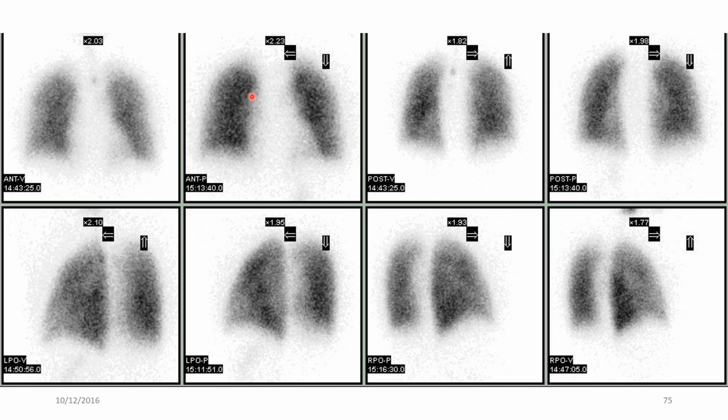And you have very nice images of potatoes, or very blurry images. But what you can see is the picture of the lungs. And the reason that we do ventilation and perfusion scans is, one looks at how well the lungs are ventilating, how well you're breathing. Because if there is an anatomical or structural defect in the mechanism of your airway in breathing, they can tell the difference to see whether you have something called a pulmonary embolism. And they always do a ventilation and perfusion scan.